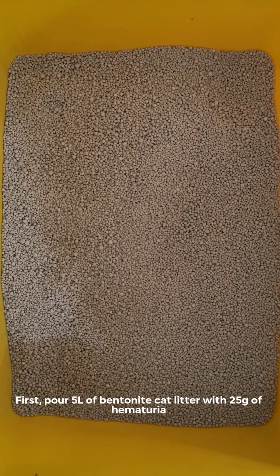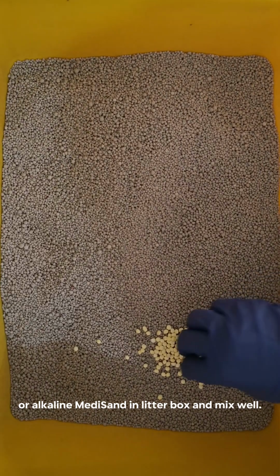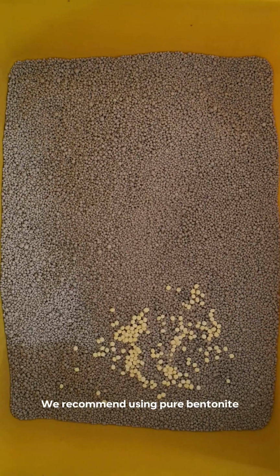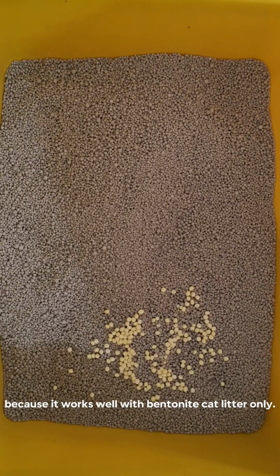First, pour 5 liters of bentonite cat litter with 25 grams of hematuria or alkaline Medisand into the litter box and mix well. We recommend using pure bentonite without flavor only, and other cat litter is not recommended because it works well with bentonite cat litter only.